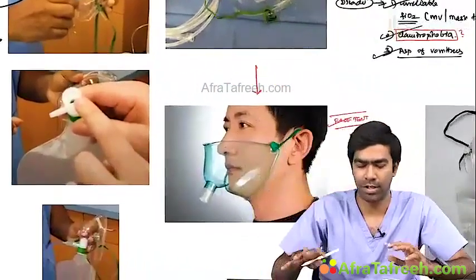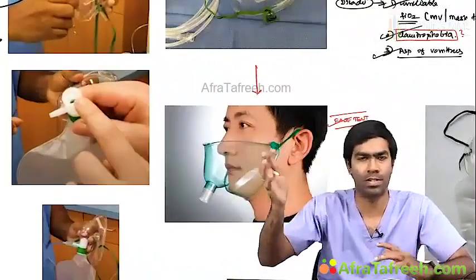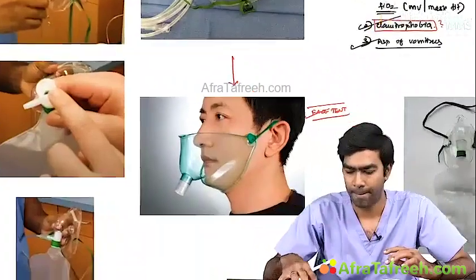You can use that in emergency scenarios if you need a little higher FiO2 to be delivered. Clear? And again, it has some problems, like the simple face mask issues. The same problem will happen: your FiO2 is still unreliable. It delivers a little high FiO2, but still it is not reliable. At the same time, aspiration of emesis is a problem, claustrophobia is a problem. All these things are a problem for this partial rebreather mask also. Now you know how to convert a simple face mask to a partial rebreather mask.